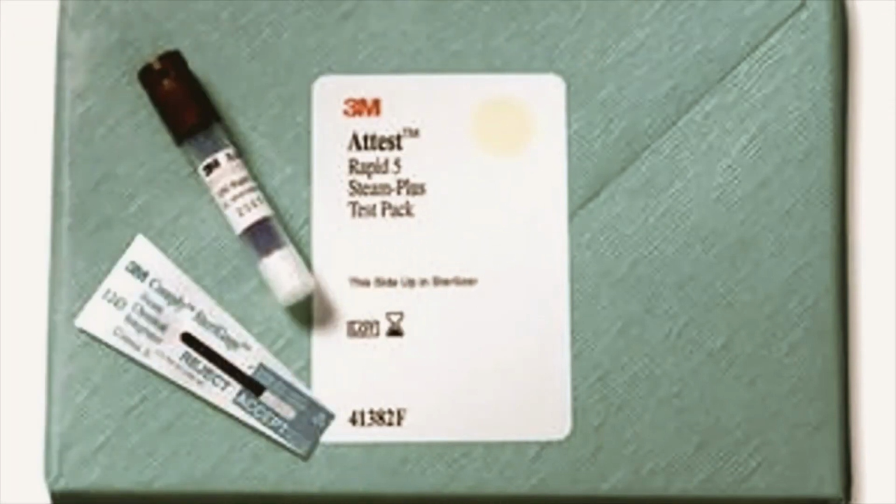Made by the 3M company. This is a very popular process challenge device. Inside the pack, there is a stack of paper that is probably about 3/4 of an inch tall, and there's a cutout in the middle. And inside the cutout, there's a biological indicator as well as a chemical indicator.